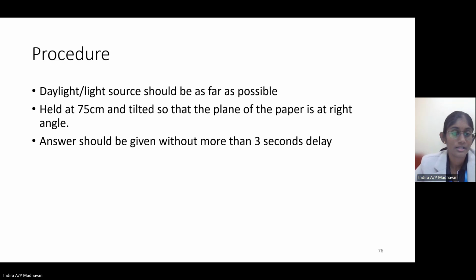And most of us, how do we do the recording? Usually we just record 14 over 14, 24 over 24, 38 over 38, whichever plate that you have. But there is an actual way of recording, which we don't need to do in practice. Usually if a person wants to conduct research, then they can use the recording form. So this is how the recording form looks like: 14 plates, 24 plates, and also 38 plates.